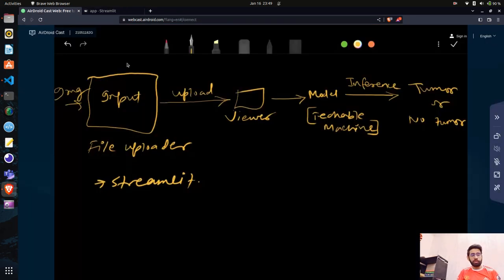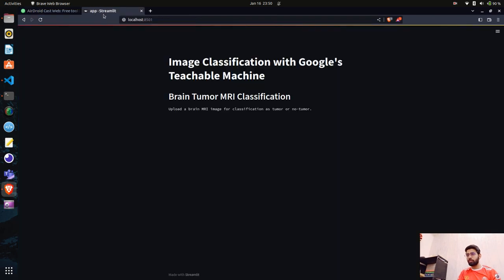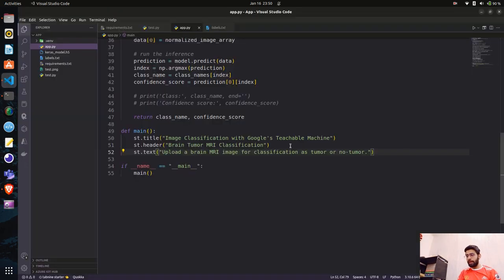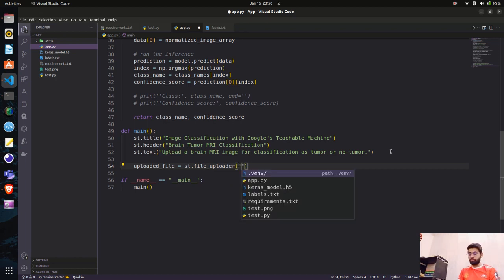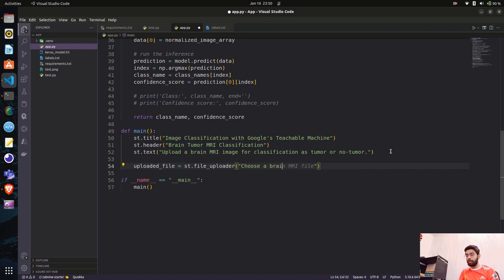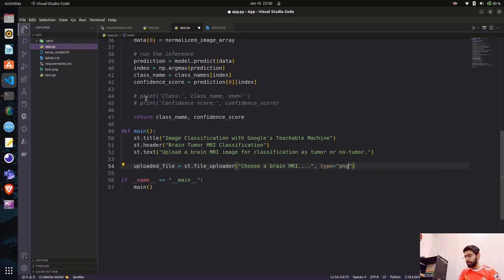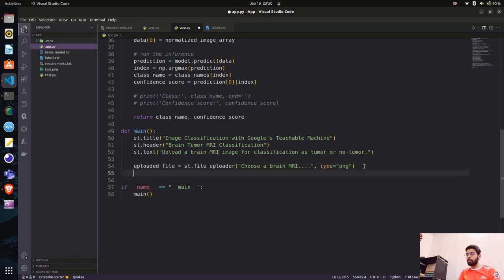For the file uploader, I'll create a variable: uploaded_file = st.file_uploader('Choose a brain MRI'). You can also pass the file type/extension — I'll give 'png' for now since I have a test.png sample image. You can also give jpg or jpeg. So this is the file uploader widget.